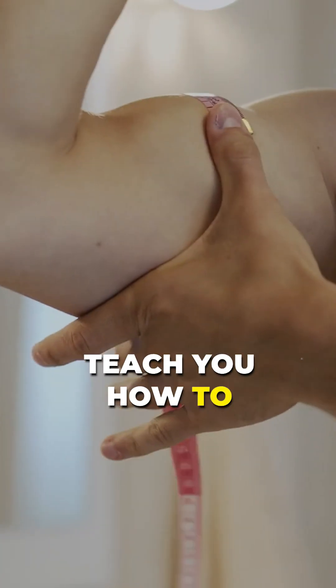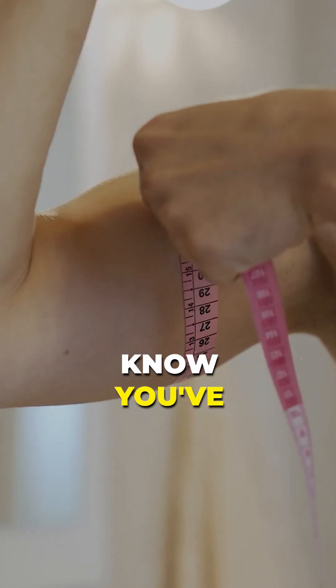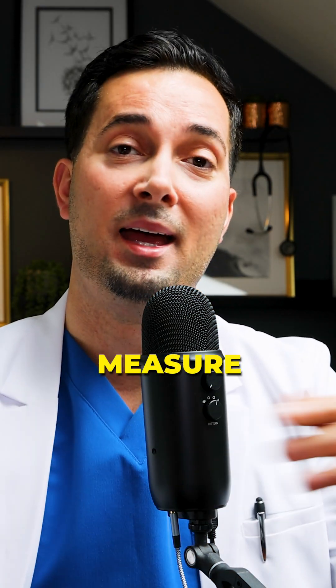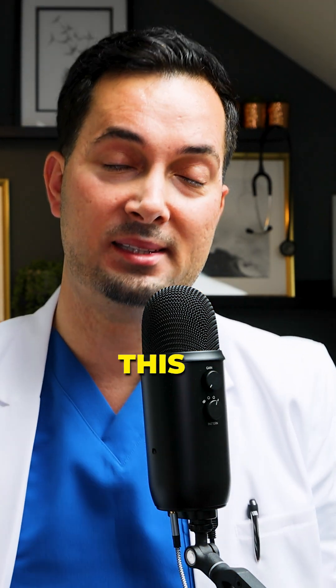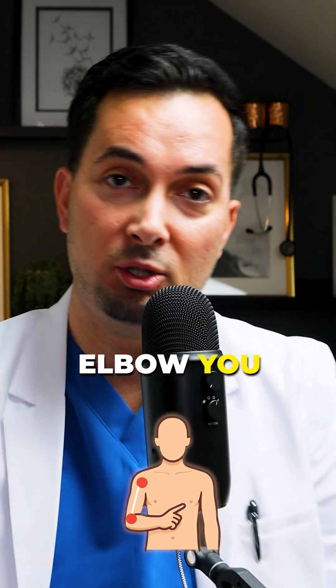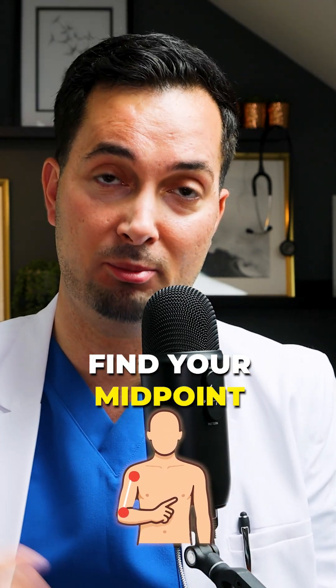First things first, I'm going to teach you how to actually measure your arms so you know you've got the right cuff size. In order to do this, you're going to grab yourself a tape measure and then find your midpoint. This is basically the point from your shoulder to your elbow. You can use the tape to find your midpoint.